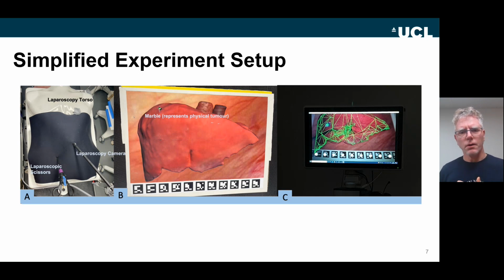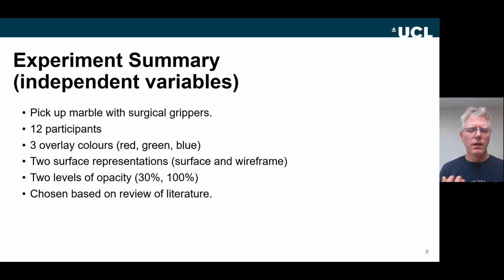On the right, we've got the augmented reality display. So it's showing the feed from the laparoscope overlaid with a wireframe model of the anatomy with a target for where the marble is. And we're getting the participants to try and extract that marble under augmented reality guidance.